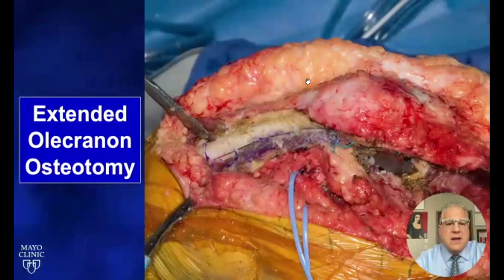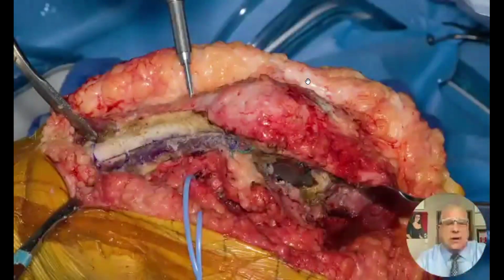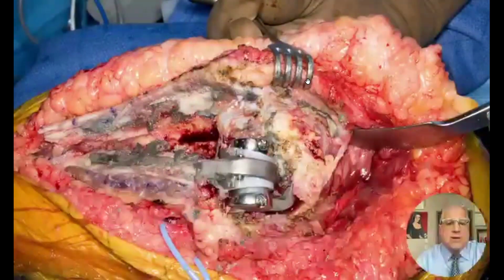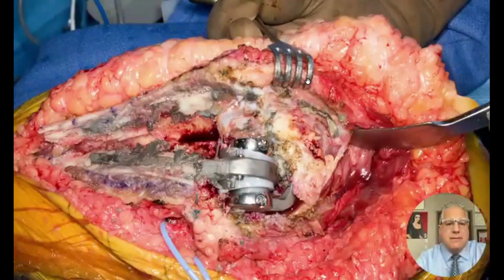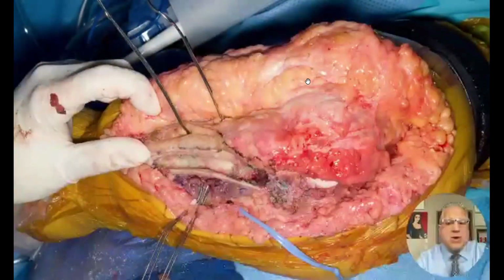On the ulnar side, especially when there is infection and we need to remove all the cement, it may be useful to perform an extended olecranon osteotomy, where the medial cortex is divided with a saw, laterally perforations are created, and the dorsal cortex of the ulna is mobilized laterally to remove the implant and the cement. This can then be repaired with circumferential wires or sutures.